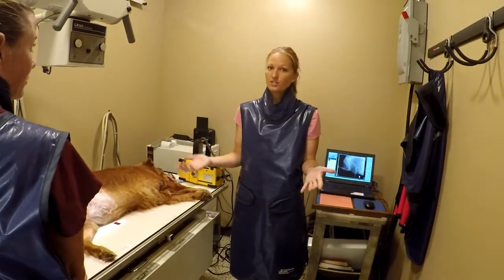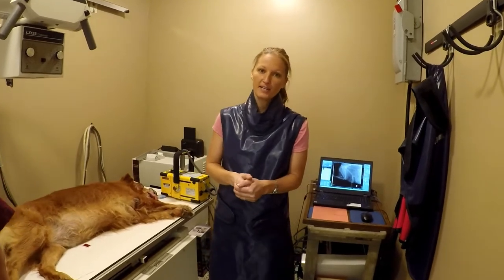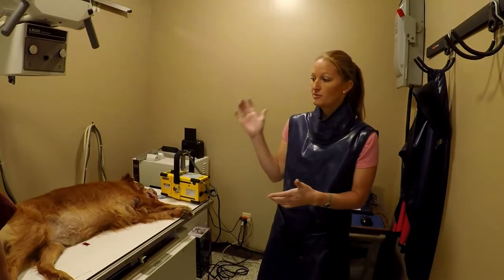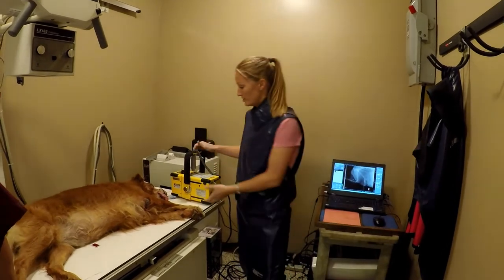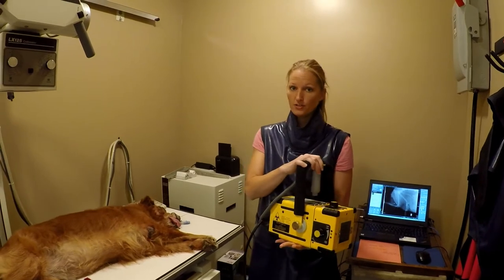We do keep our machines very up-to-date. This is our third unit — we're constantly upgrading and updating our equipment, so this is the newest state-of-the-art equipment. We also have this yellow machine here, which allows us to take portable x-rays.